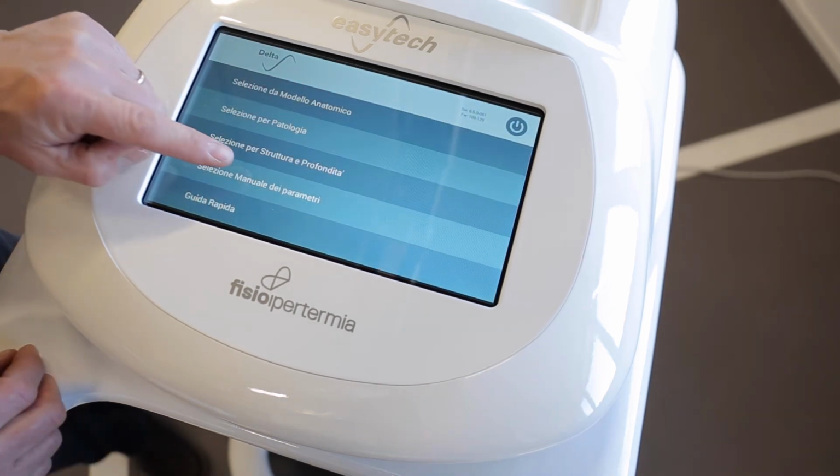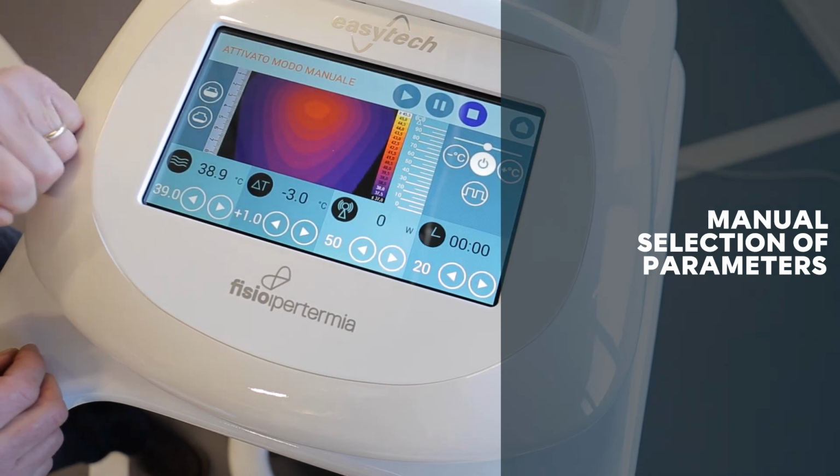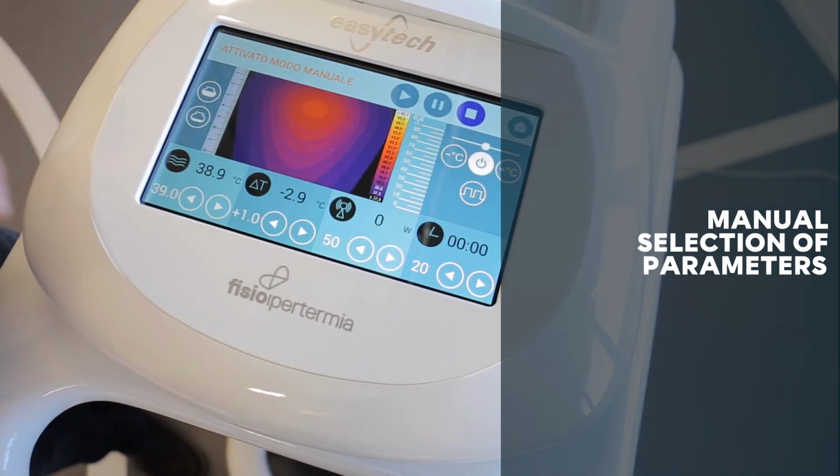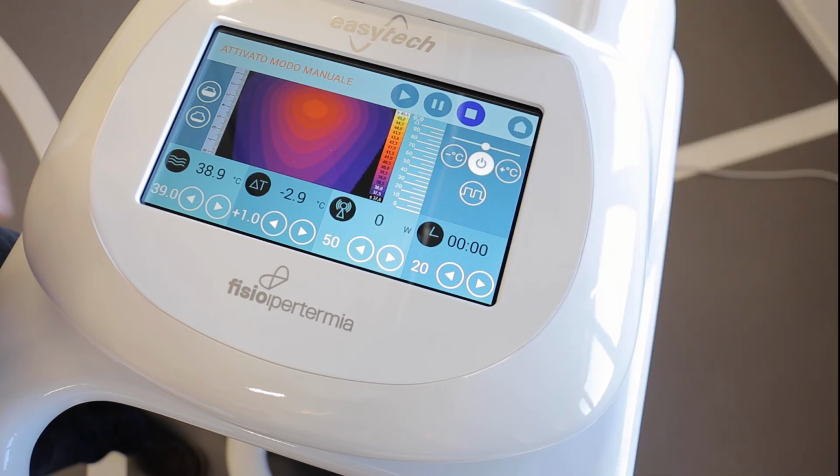The fourth and last way to set up a treatment is by manually selecting all parameters. But please note that this modality requires in-depth knowledge of the equipment. To define the parameters, please use the white buttons at the bottom of the main screen. It is possible to adjust the temperature of the water inside the bag, the delta value, which regulates the depth of the treatment, the watts or maximum power delivered by the generator, and the duration of the treatment.